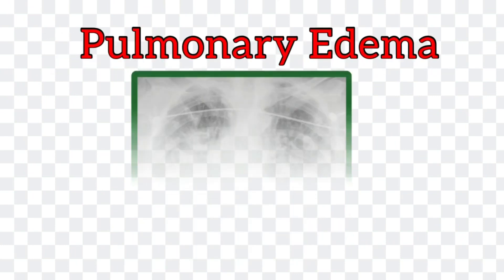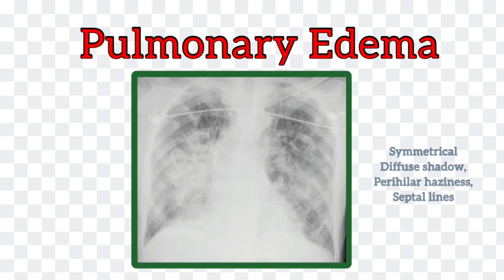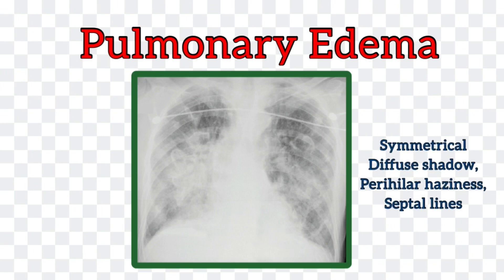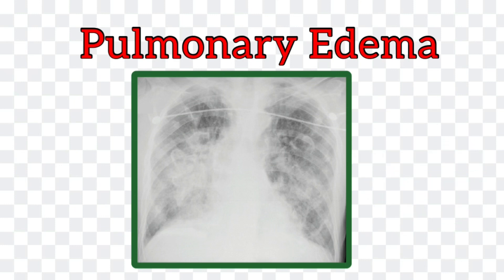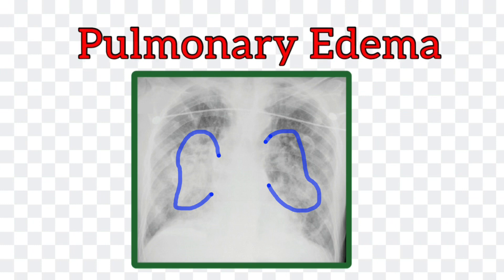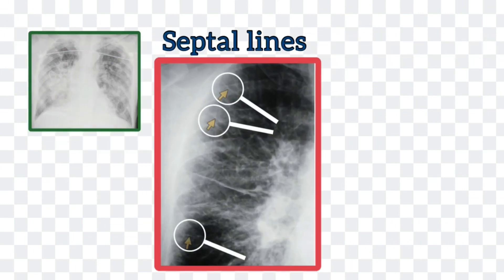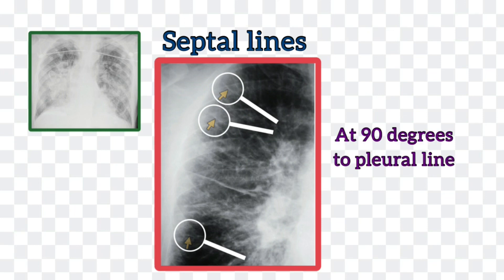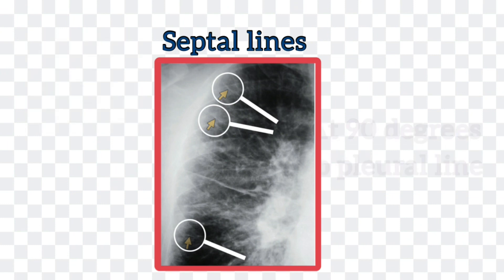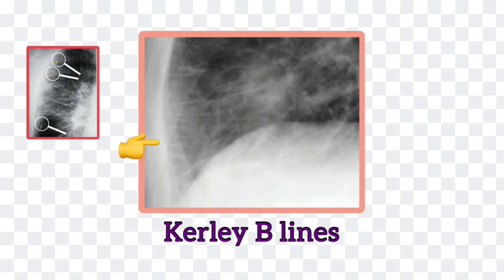Now look at the x-ray of pulmonary edema. It is characterized by symmetrical diffuse fuzzy shadowing with perihilar haziness and the presence of septal lines. In acute pulmonary edema, we can see the batwing appearance of shadowing. Septal lines are caused by engorgement of pulmonary interlobular septal lymphatics by fluid. They can be seen in the periphery of the lung, extending inwards from the pleural space, and on a chest x-ray they run at 90 degrees inwards from the pleural space. Kerley A lines are the septal lines in the central portion, while Kerley B lines are the septal lines at the base of the lung.